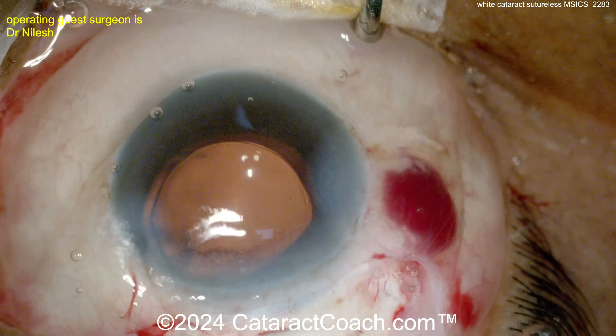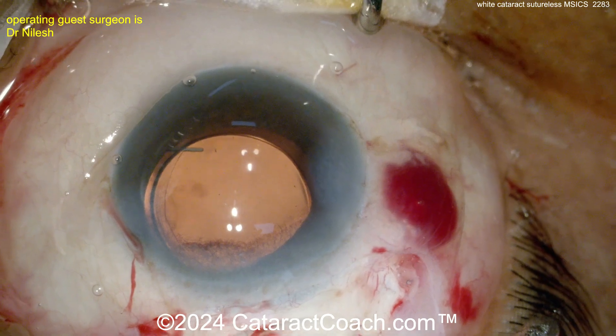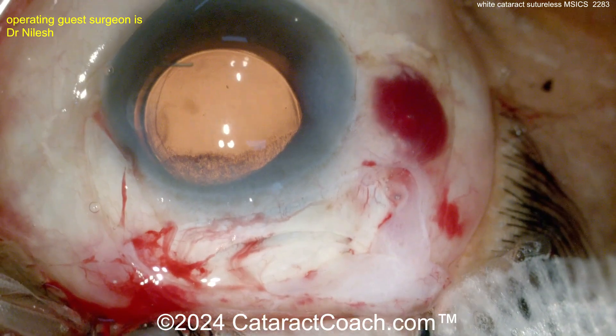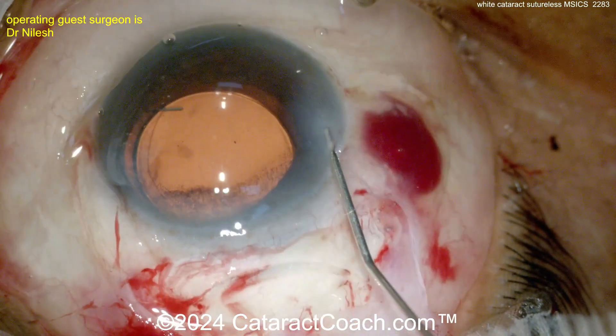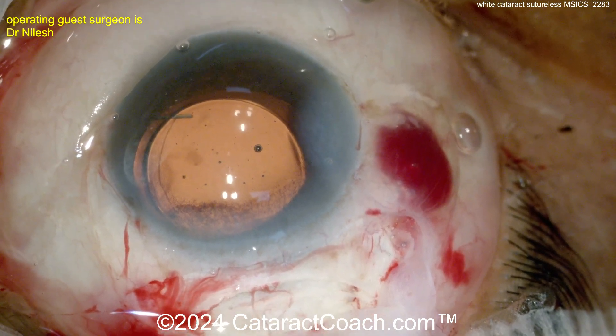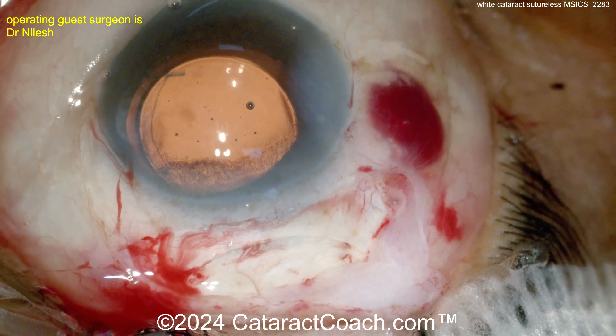Now hydrating up the paracenteses and then the main incision to normalize the pressure in the eye. Then you check the incision to make sure it's totally watertight — if you can push on the eye and it doesn't leak, you're happy. This incision will cause some astigmatic flattening, but not terribly so — maybe a diopter or two.